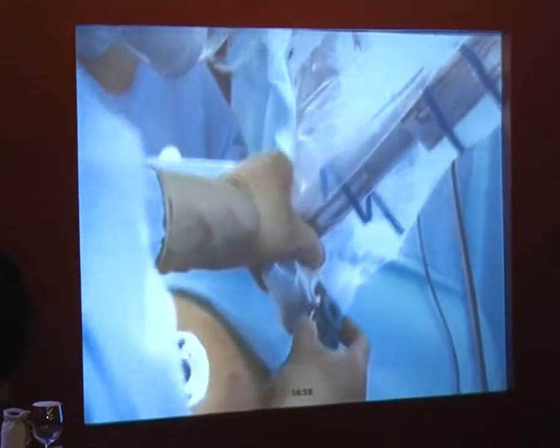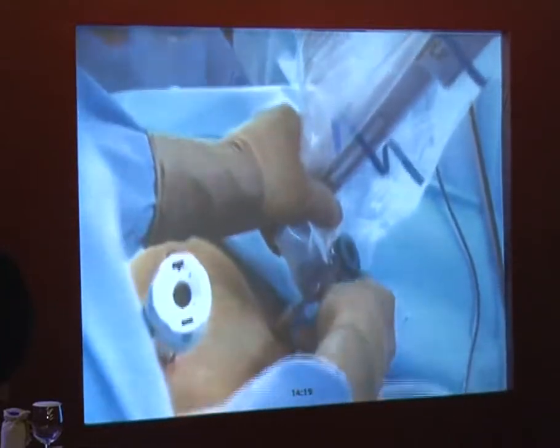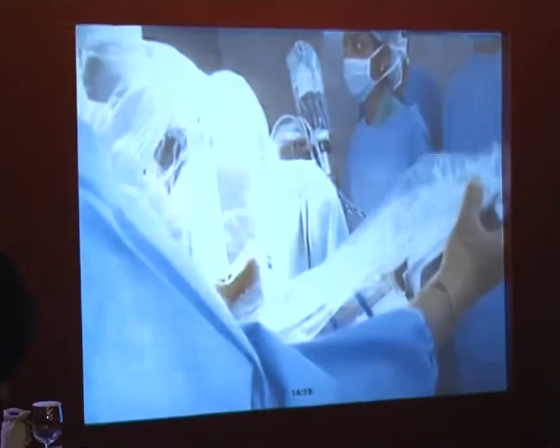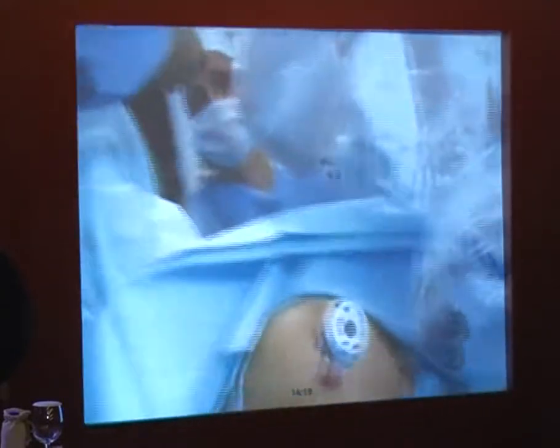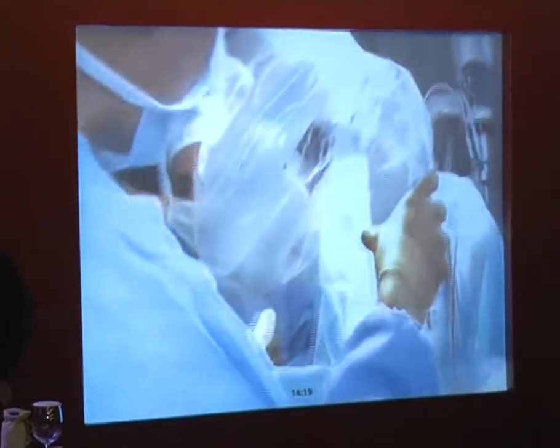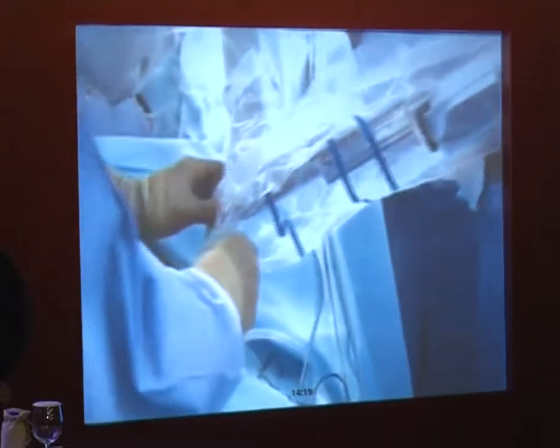Arnie, what kind of uterine manipulator are you using? We're using the Advincula Arch, which is a uterine manipulator that I designed with Cooper Surgical. It's just a simple metal arc. We actually have one on the side table. We can show it to him. Do you have the extra one? Can we have the extra one that's in the table, please? The metal manipulator?